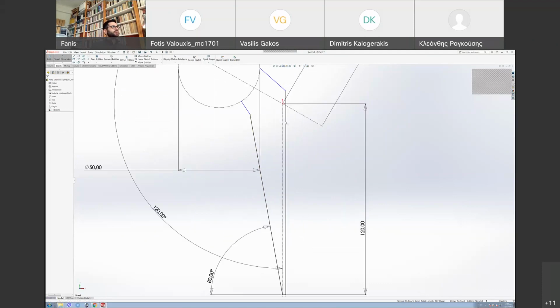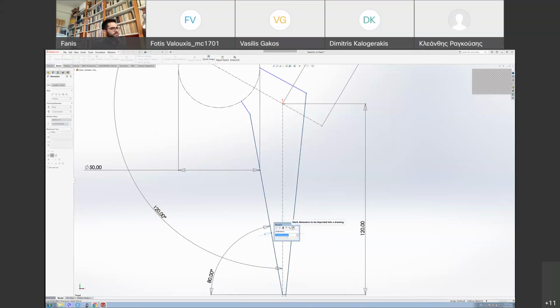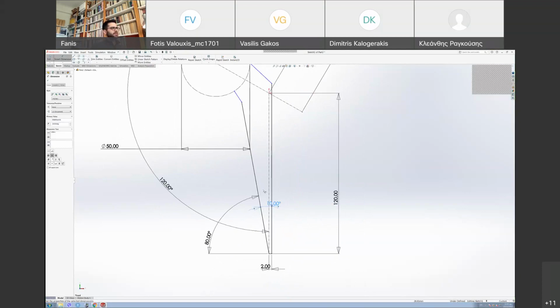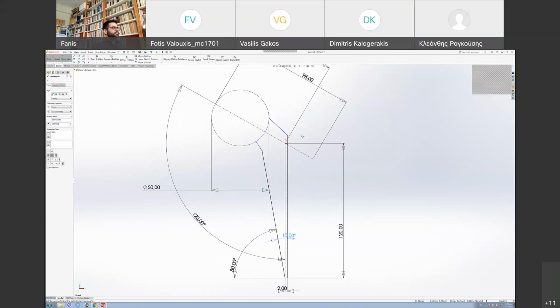Okay, so what happened? Now, for instance, this line shouldn't be vertical. That's why it's giving me all this message. I just delete that and make this a bit here so it can stand out. Sometimes you can get automatic relations in SolidWorks Sketch, and it can be pretty tricky, but just make sure you delete anything you don't need. So I'm just sketching an axis line here to help me. It's not a critical part of the design.